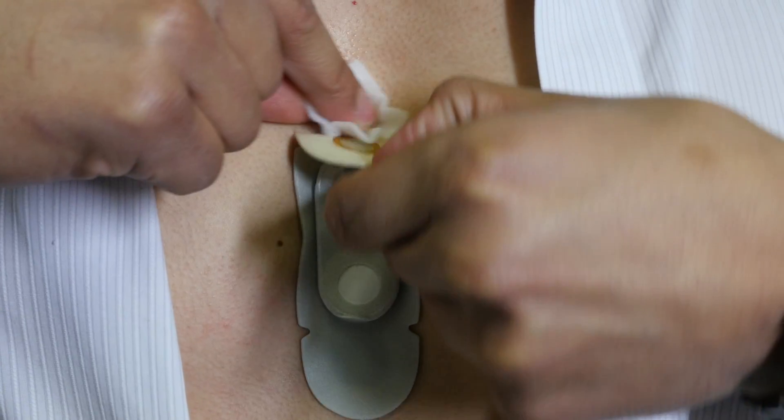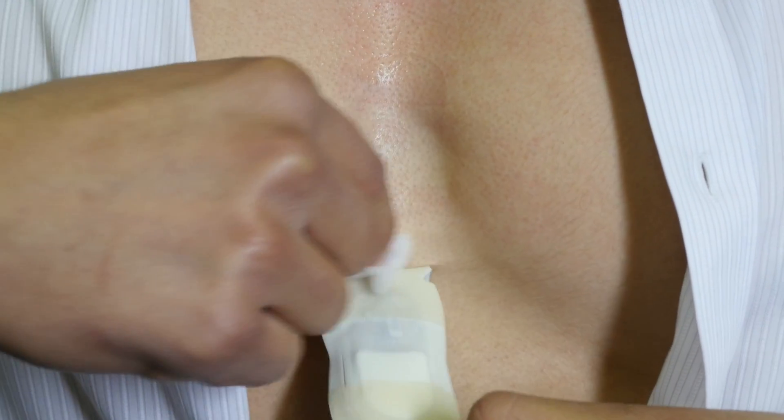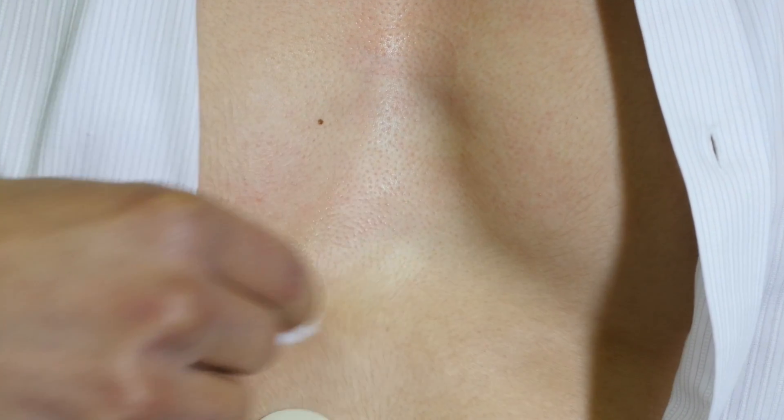Once you have completed your session with the patch, use an adhesive remover, sweeping between the skin and gently lifting the patch as you go.